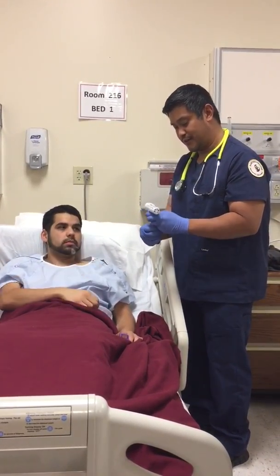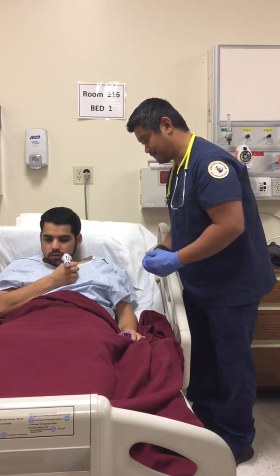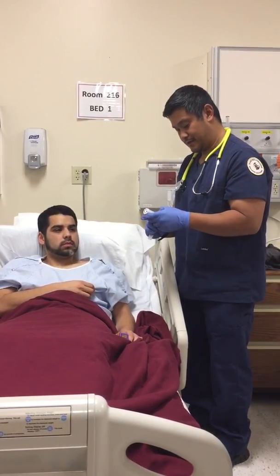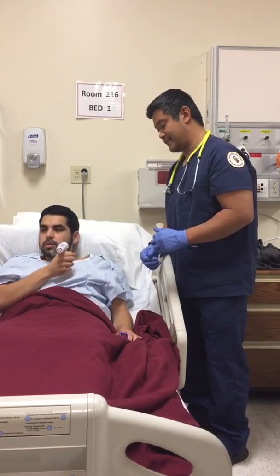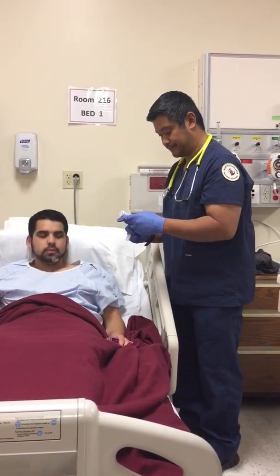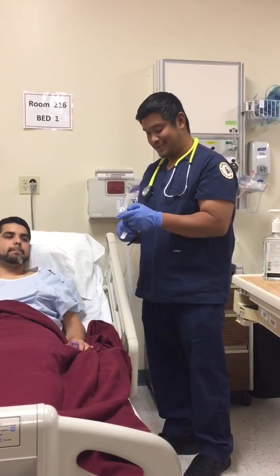We're going to do it 2 more times, all right? Do it once again. Take a deep breath in, and then blow. All right, good job. All right, one more time, all right? Okay, go. Deep breath, and blow. All right, good job, Christian. So I got a reading of 500. It's very close.